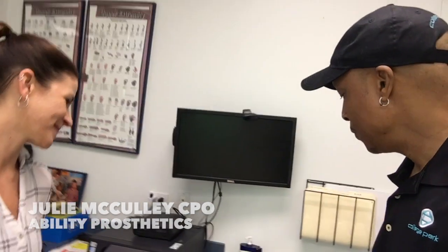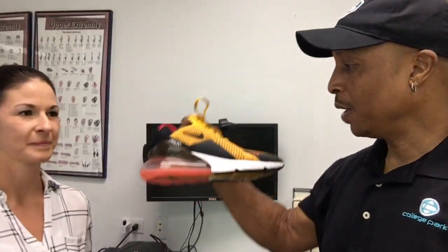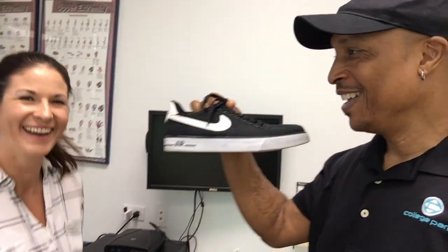Hey Julie. So here we have two of my favorite shoes — one has a heel and one does not. What advice can you give to other amputees that don't have an adjustable ankle foot — because I know some of you do have adjustable ankle feet — to maintain proper leg alignment when they switch between different shoes?